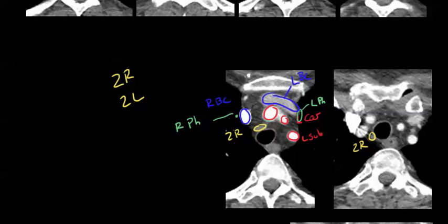Your vagus is going to be coming down along in this area here — left vagus. And your left recurrent laryngeal is going to be going in this esophagotracheal groove. You've got your esophagus back here, and of course your trachea in the middle.